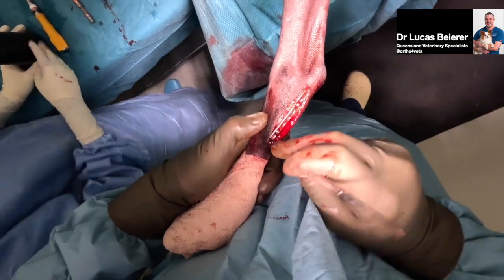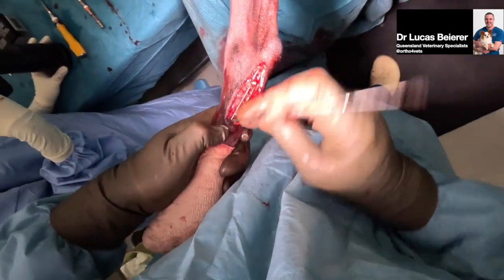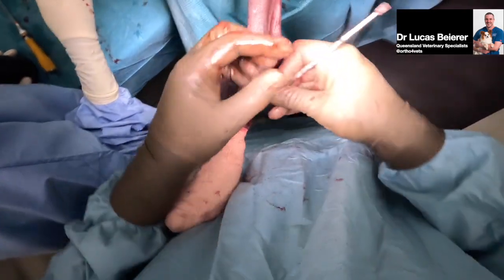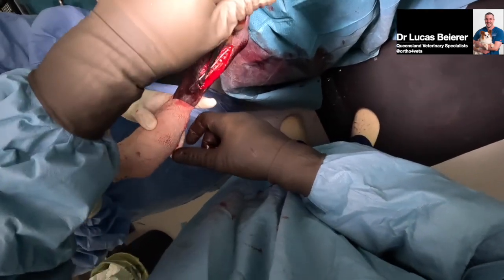We'll do a locking 2-4 here. See where this is. Have to pull this plate down a little bit. Hold the leg. That locking guide.